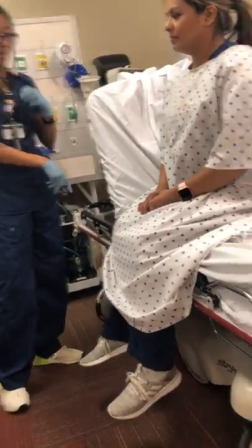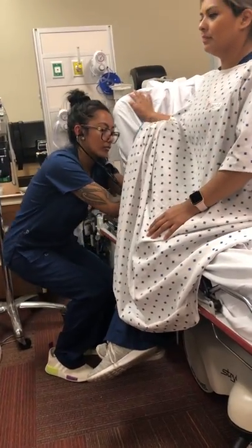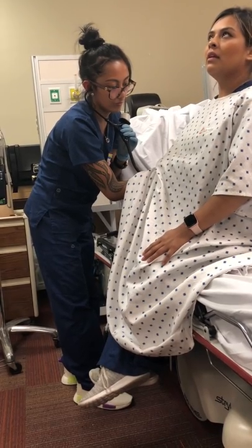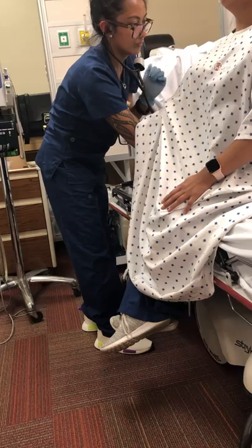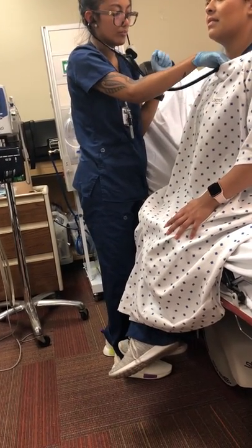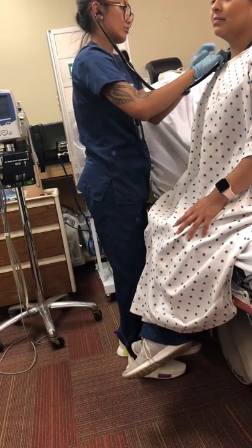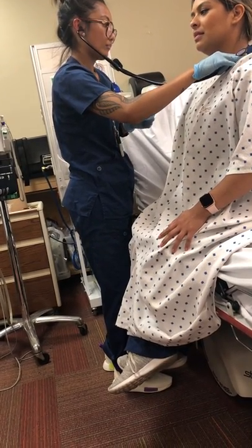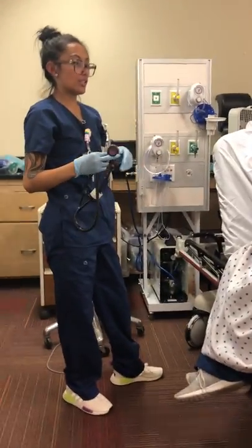I'm going to go underneath the patient's gown to keep the patient's privacy. Continuing auscultation across the anterior fields, going by the clavicle. The last is your neck — go ahead. Your throat is clear, no stridor. But I did hear wheezing in the front and at the bases as well, so we will give you the Duoneb to help with that.